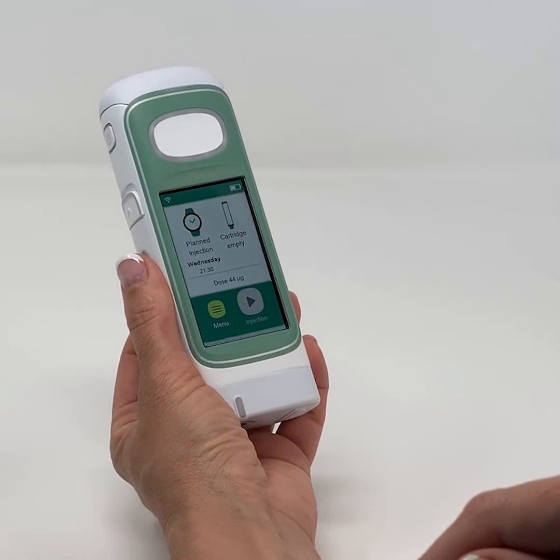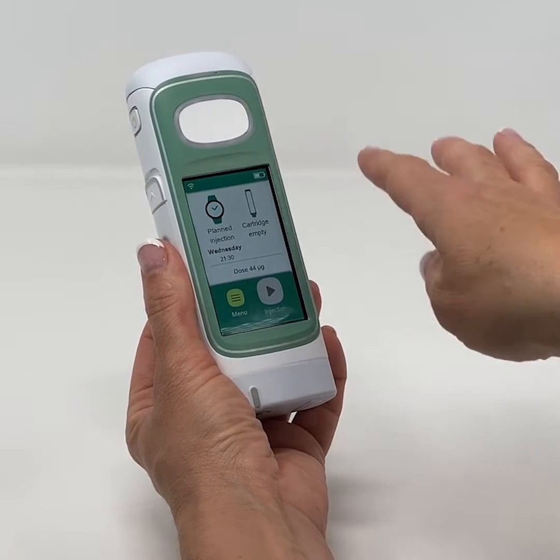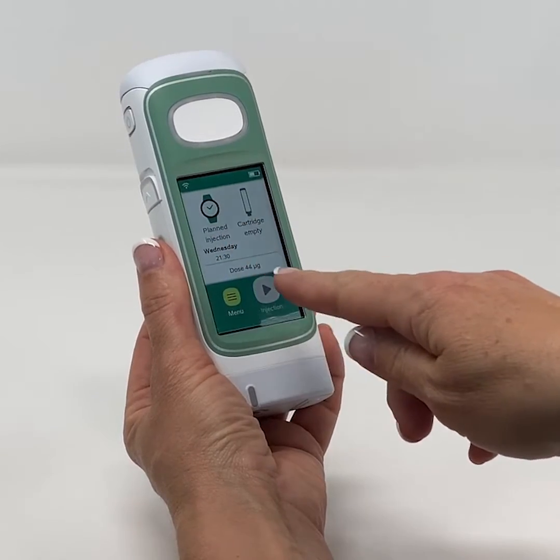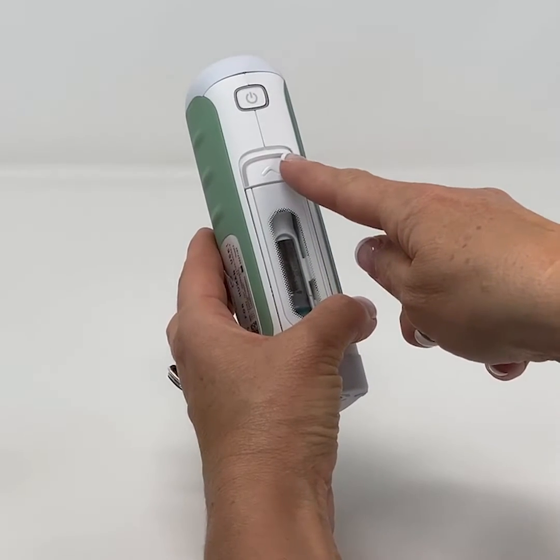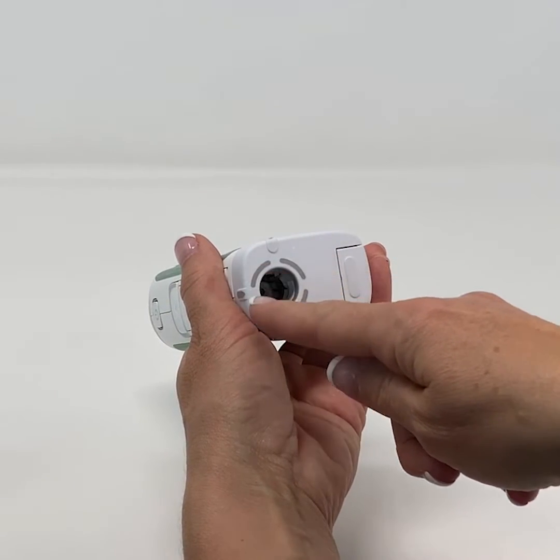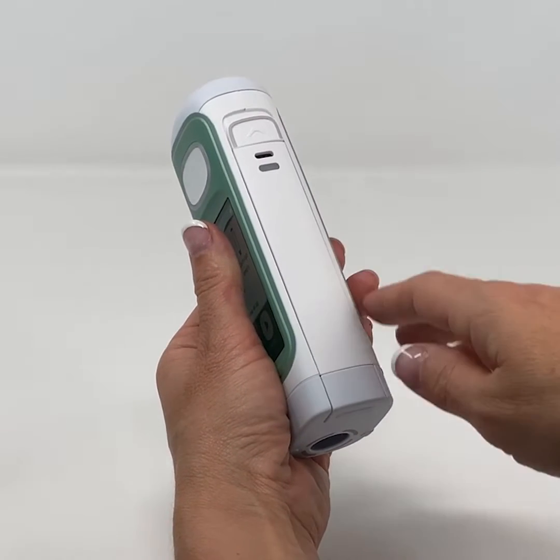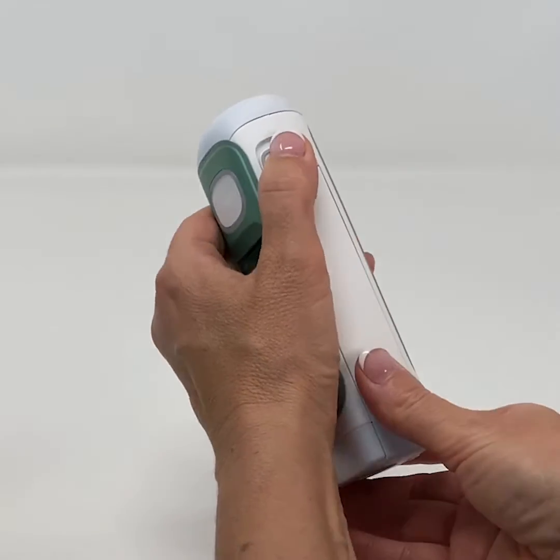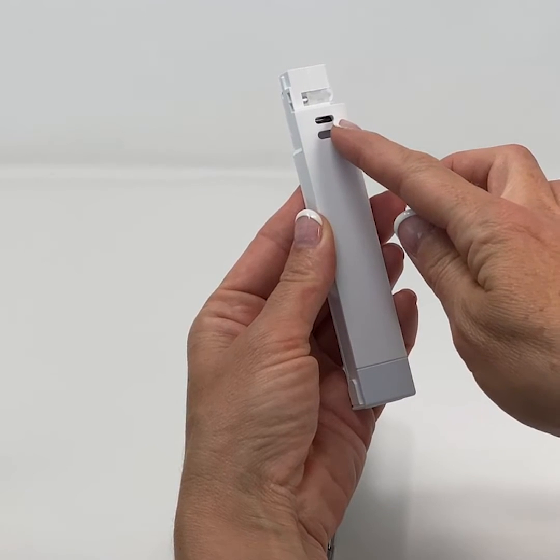Key features of the device include: the injection button, the front cover, the touch screen, the on-off button, the cartridge door latch, the needle cavity, the skin sensor, the battery latch, the rechargeable removable battery, a USB-C port, and a charging indicator light.